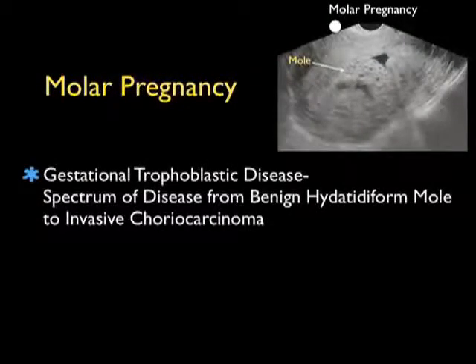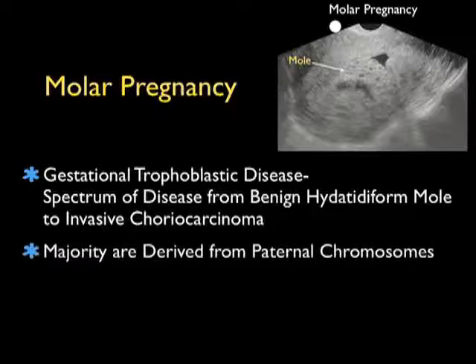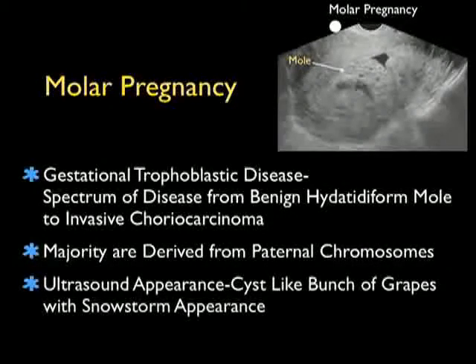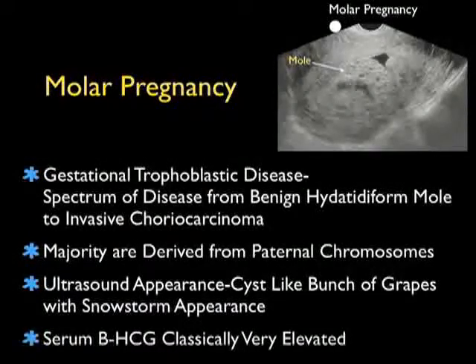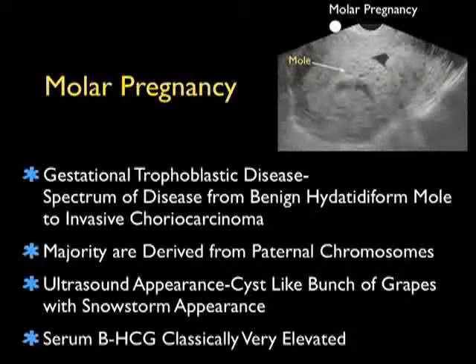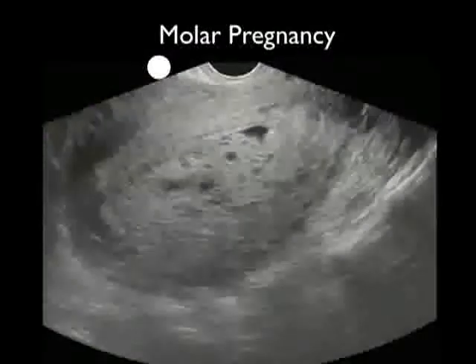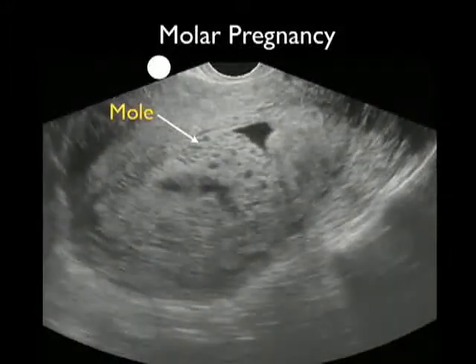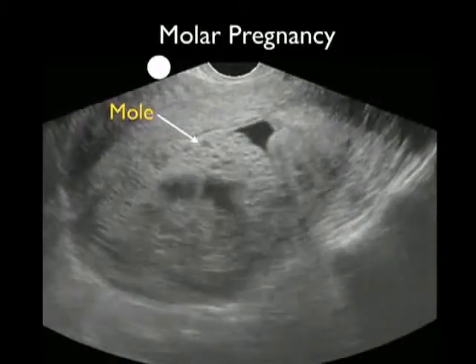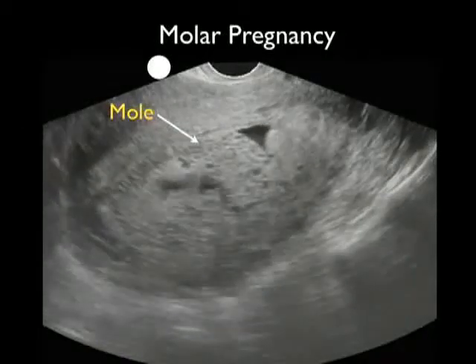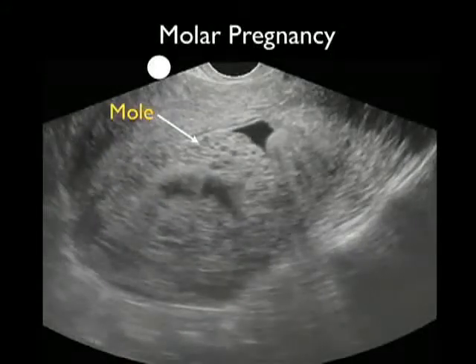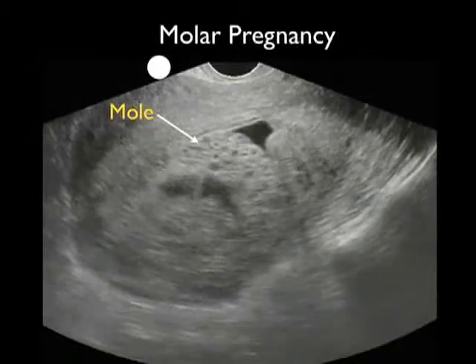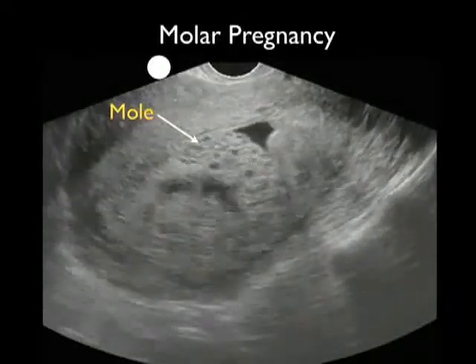I'd like to conclude this module with another form of abnormal pregnancy: a molar pregnancy, which is a form of gestational trophoblastic disease. This ranges from a benign hydatidiform mole to invasive choriocarcinoma. The majority are derived from paternal chromosomes with no maternal chromosomes in the embryo. The ultrasound appearance will be a cyst-like bunch of grapes with a snowstorm-type appearance, and classically the serum beta-HCG will be very elevated. Here's video from a patient who presented with uncontrolled hypertension, vaginal bleeding, and pain. We see the molar pregnancy within the fundal region of the uterus — a cyst-like appearance very different from a normal intrauterine pregnancy, almost like a bunch of grapes within the fundus. My next move was to get an OBGYN consultation stat.